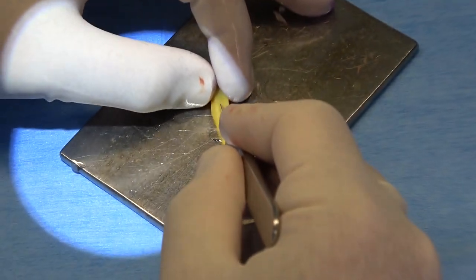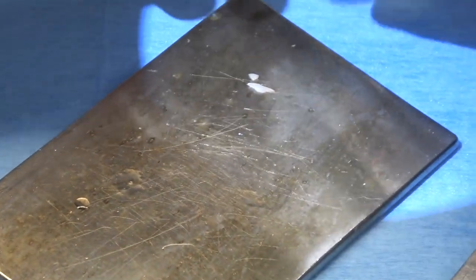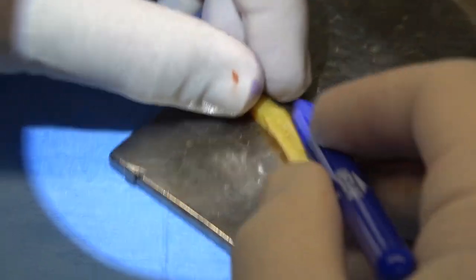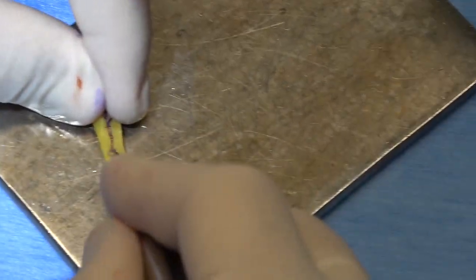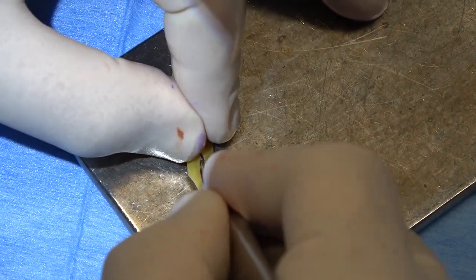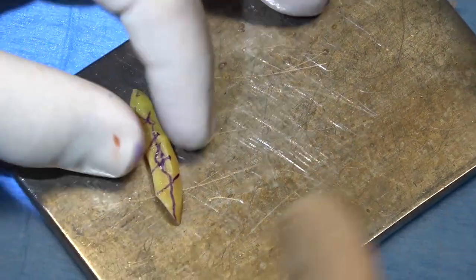So give me a knife. You will just try to cross hatch the graft. Give me marking pen. Right up first. Okay. You mark it, Ben. We'll cross hatch it this way. Sorry, straight line first. Okay, give me that. Okay, give me a marking. And then we'll cross hatch it this way. Oblique.